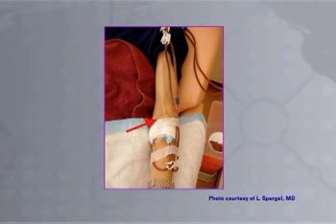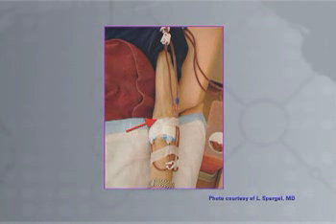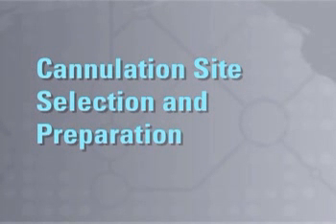AVG that is suitable for conversion to a fistula. Now you are ready to select sites for cannulation and prepare the needle site. Infection is a major concern with any vascular access, and Staphylococcus is the leading cause of fistula infections in dialysis patients. Proper needle site preparation by both the patient and staff reduces rates of infection.